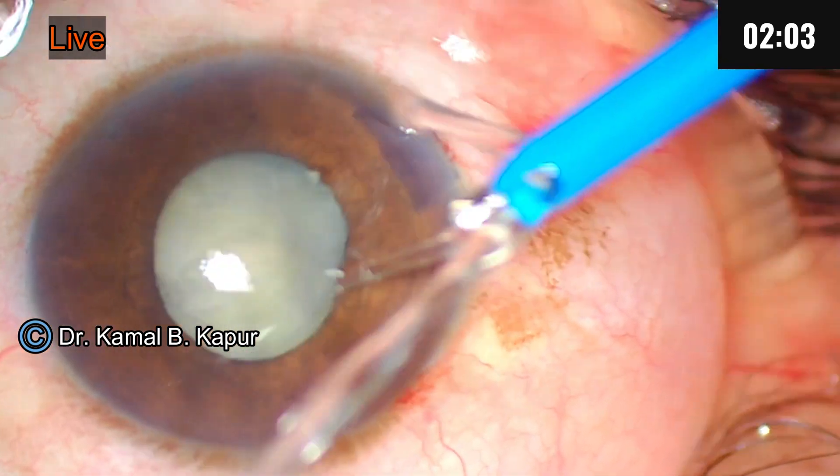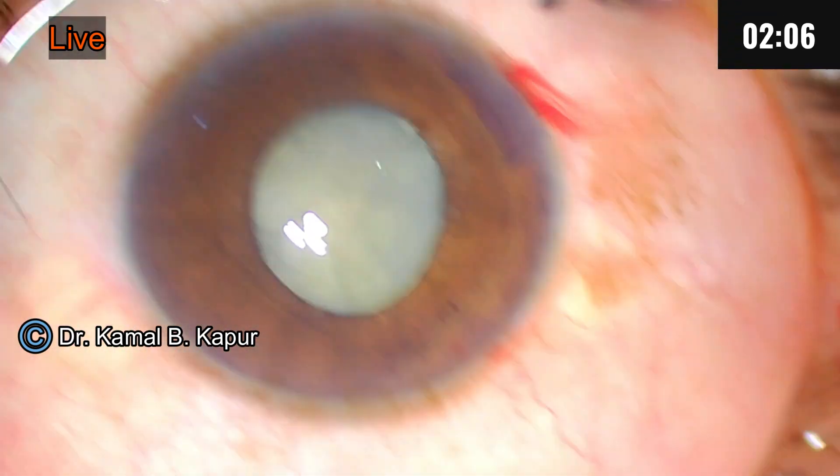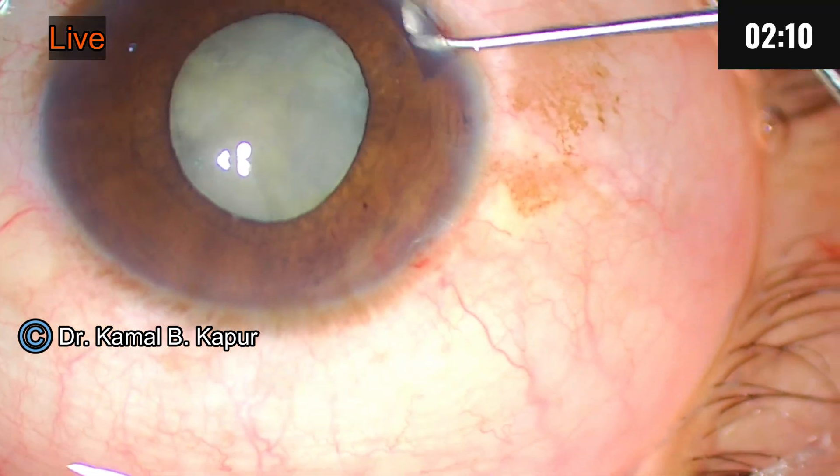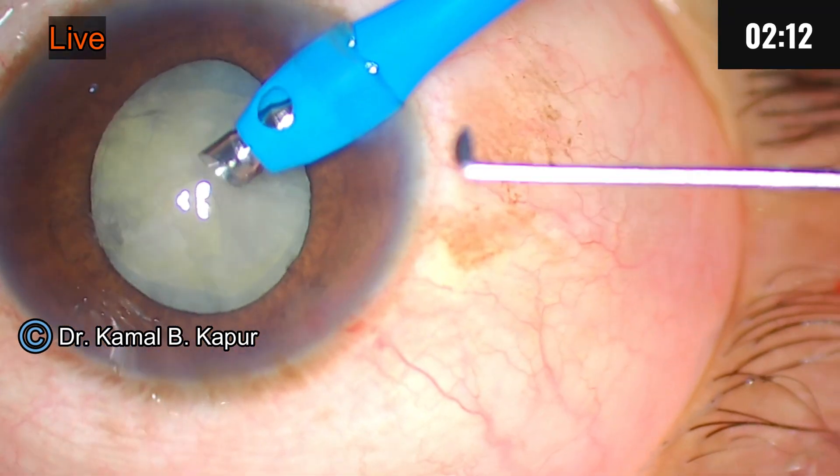Now we will expose the phaco tip slightly more since it's a hard cataract. Madam, lift the corneal wound when you go in.